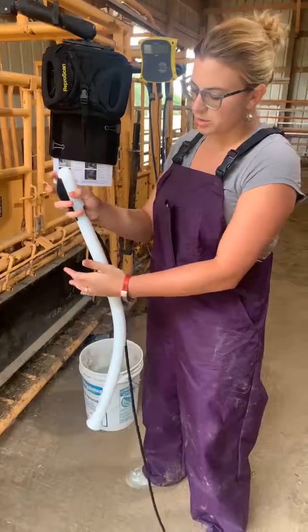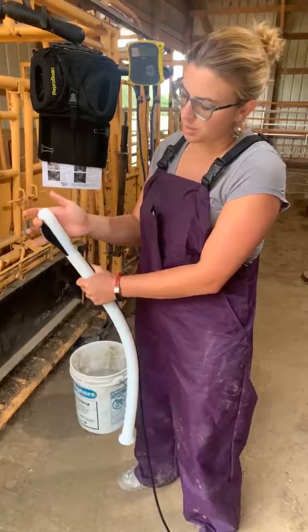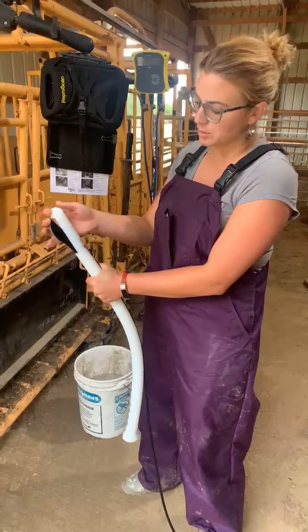What we want to do is essentially straighten the white piece of plastic. I'm going to lightly hold with my finger on the probe and actually pull with my index finger on the front — the tip of this repro arm.